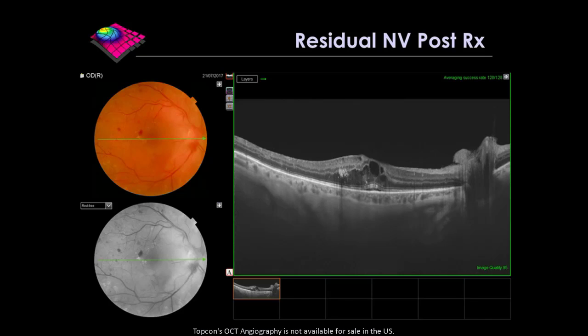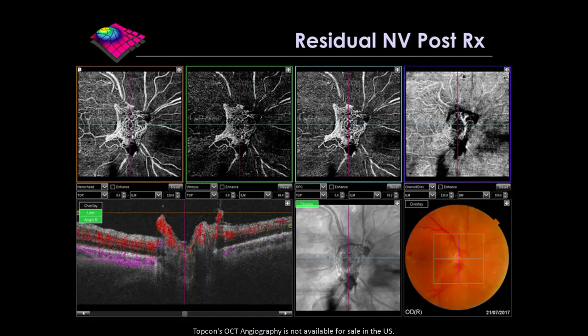Now, here is the main thing that we're interested in. And we do the angiodisc. And what you can see is very nicely that there's the neovascularization at the disc. Now, a key point that I want to highlight, though, is that in a lot of these patients, rubeosis, proliferative diabetic retinopathy, cataracts, they often have motion artifacts with them, or you might struggle to get very high quality scans in some cases, and sometimes the en face images don't show this as beautifully as you would like.